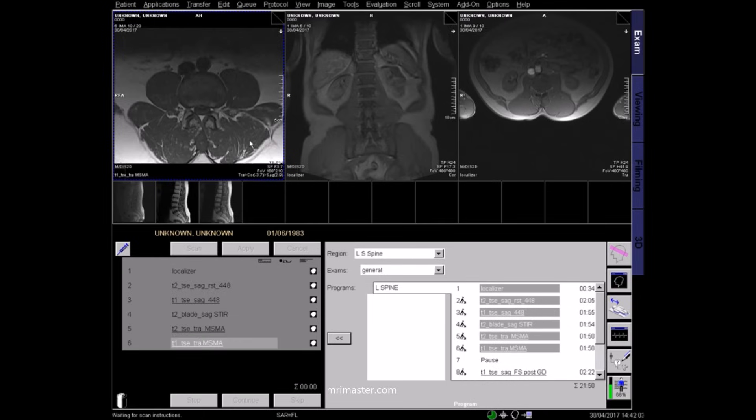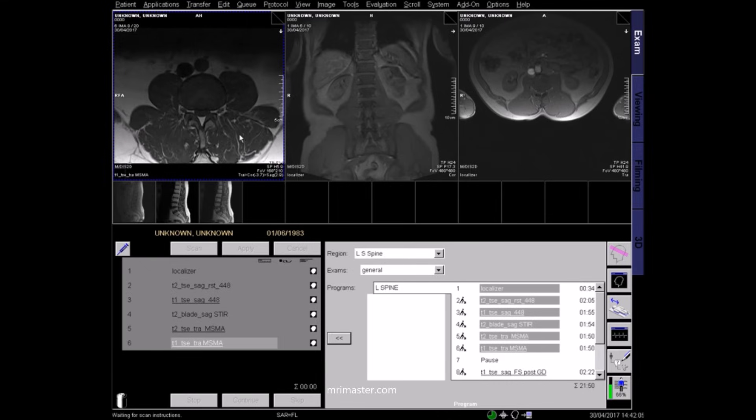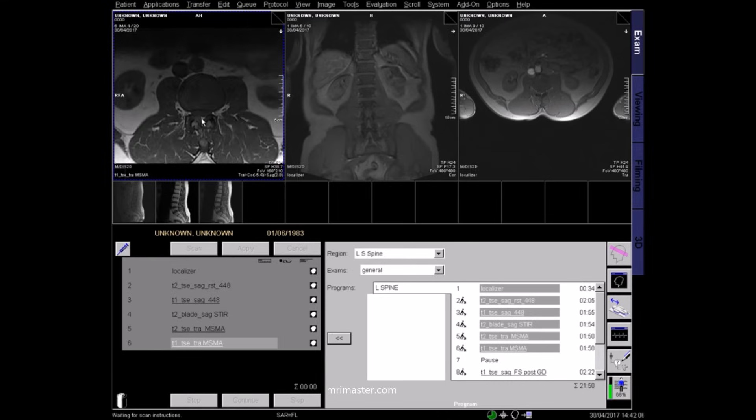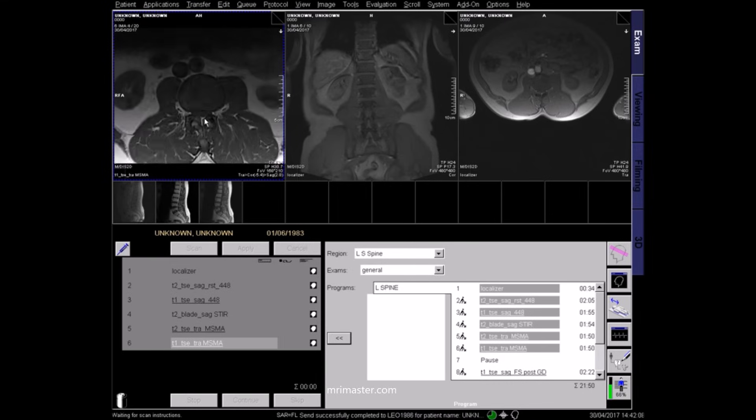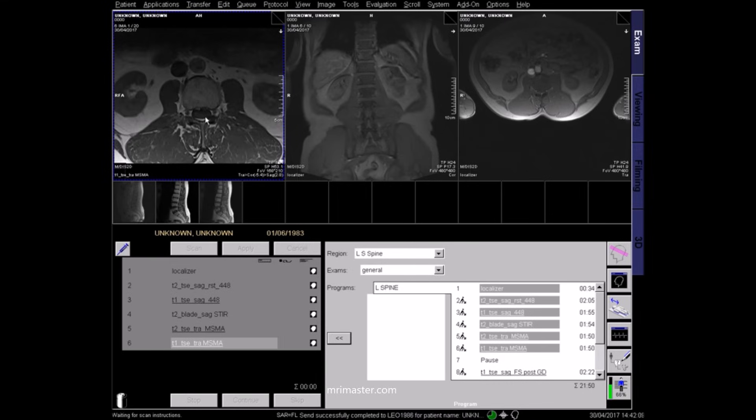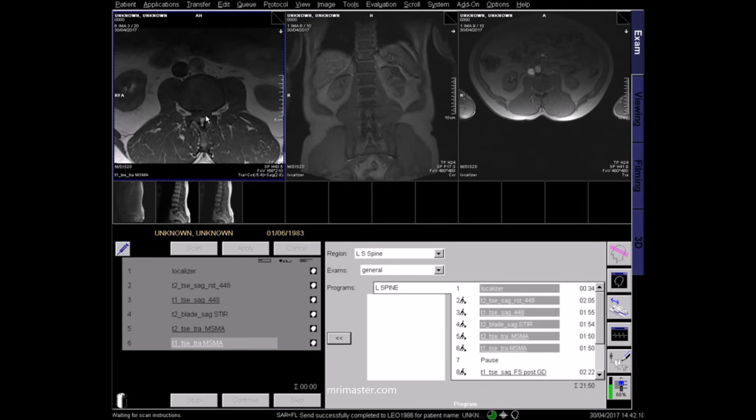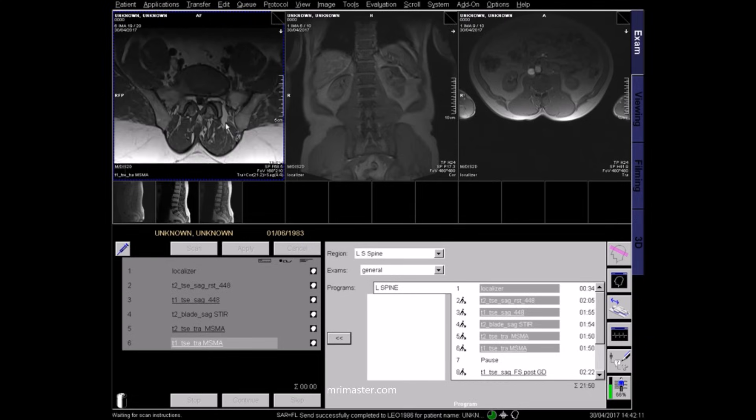And this is a multi-slice, multi-angle T1 image, where the CSF appears dark and the spinal nerves appear grey.